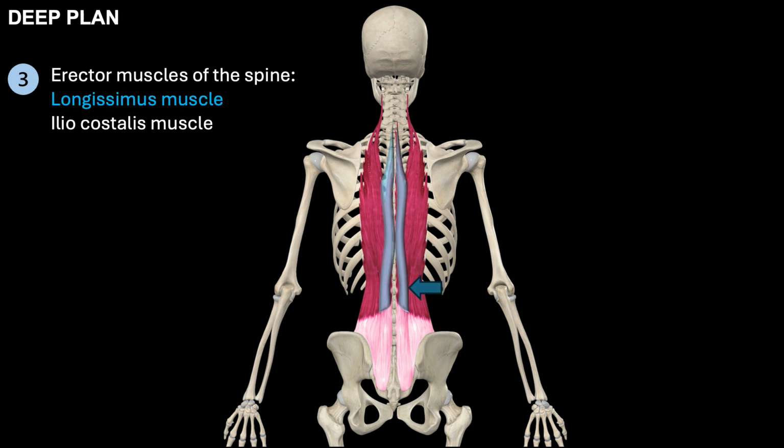The longissimus is a thick, wide muscular band located behind the multifidus. It stretches from the common tendinous origin up to about the 2nd rib posteriorly. It also sends bundles towards the transverse processes of the thoracic and lumbar vertebrae, as well as the lower margins of the ribs.